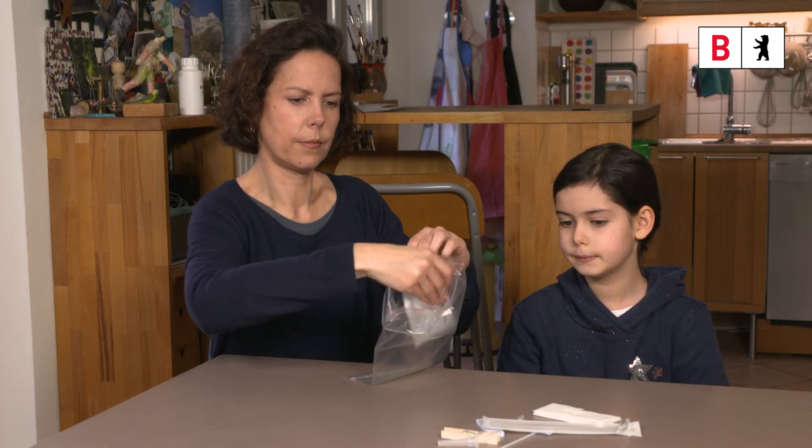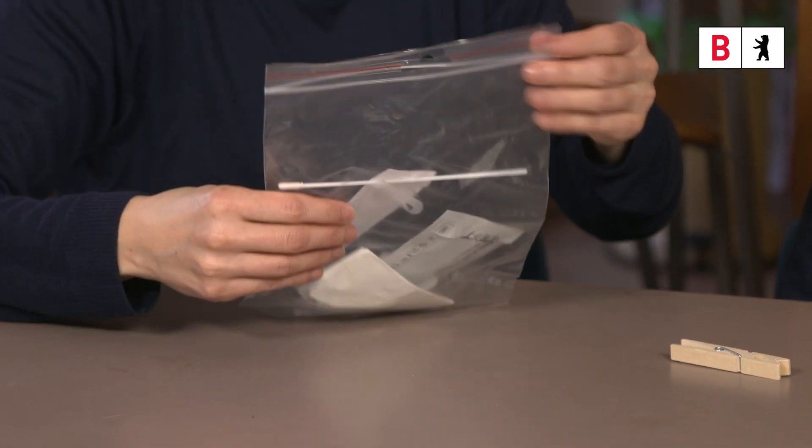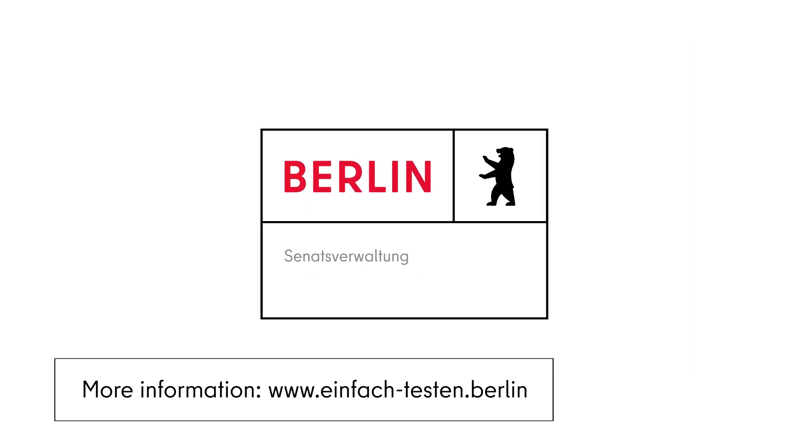Step 8. Properly packaged up, the used testing materials may be safely disposed of within household refuse. More information, including about testing centres, can be obtained at www.einfach-testen.berlin.